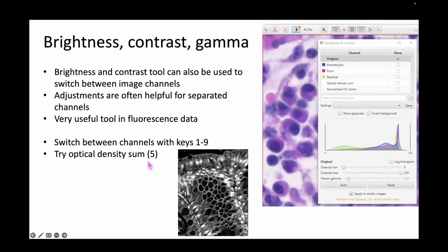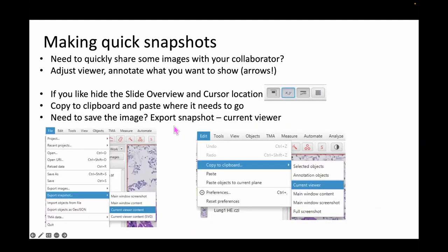There is a channel called optical density sum, accessible via keyboard shortcut number 5, which is very helpful when working with hematoxylin and DAB-like images. Those adjustments are also super useful when working with fluorescence data.